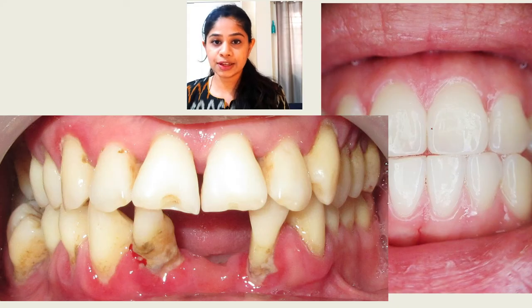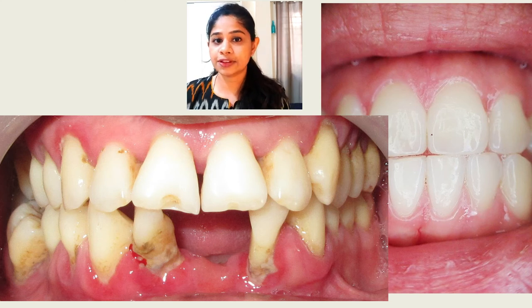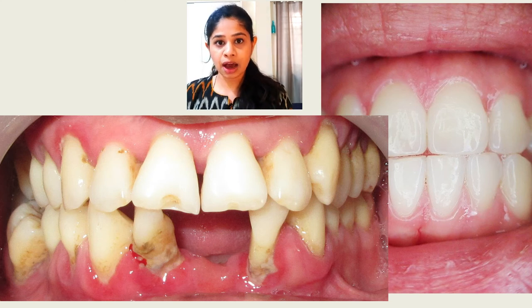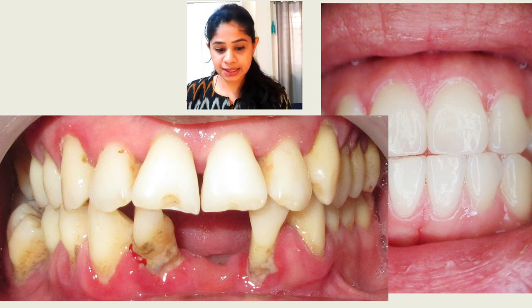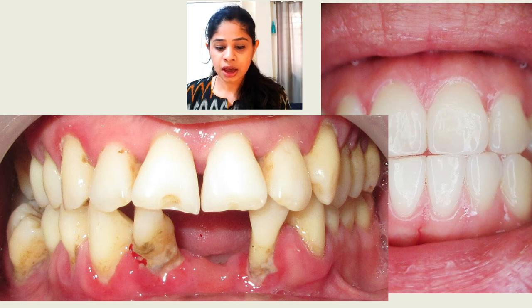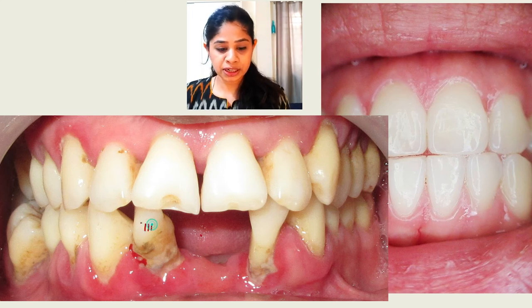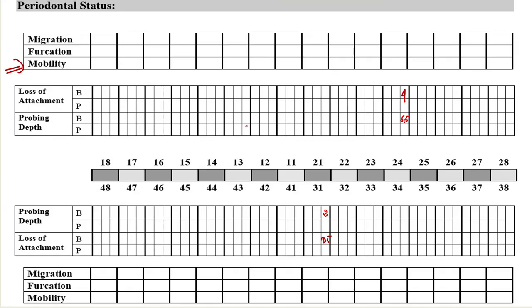In case of health, the tooth is associated with only physiologic mobility. Whereas in our diseased state, if we look at the laterals, both of them appear to have a mobility which is grade 3. Going back to our chart, mobility is present in case of the lower anterior teeth; the mobility in case of the laterals is grade 3.